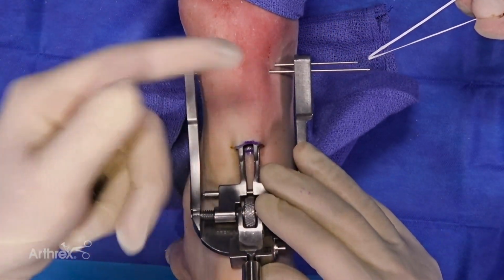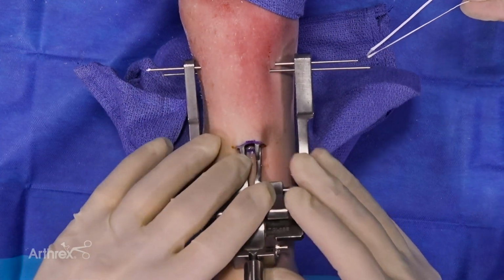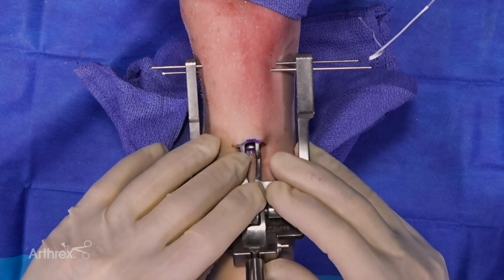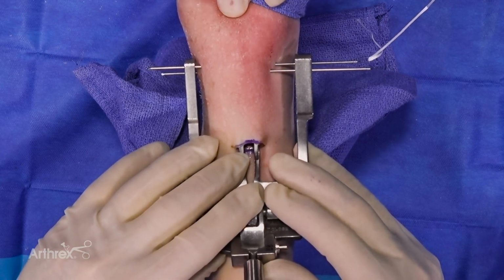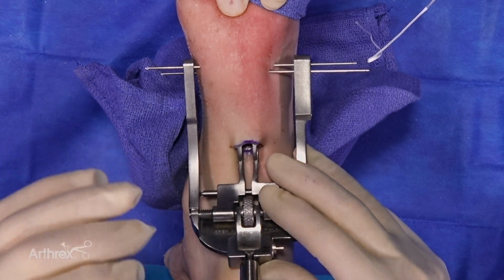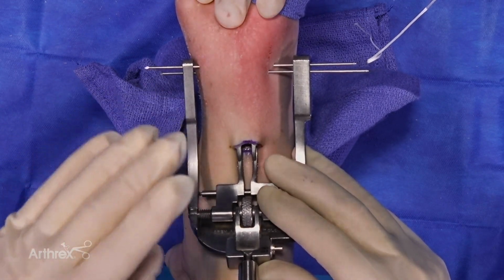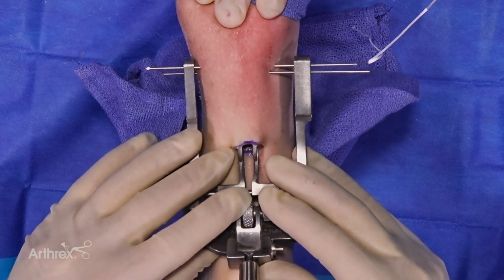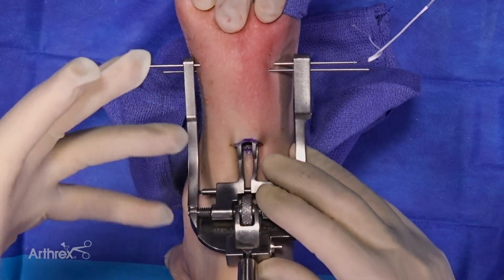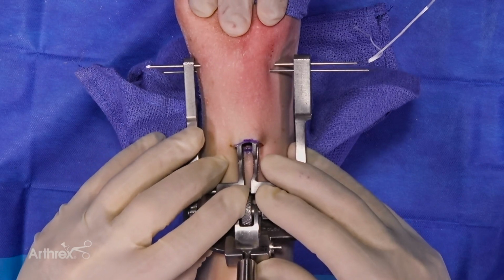So I'll take the white suture tape, and again, this is a good time to mention that while we used FiberWire very successfully for many years, over the past year I've gone to using the SutureTape exclusively. I like the SutureTape because it gives me a much smaller, softer, less prominent knot, so I have less concern for knot irritation. The other advantage of SutureTape is it has better pull-through strength for soft tissues like the Achilles tendon.